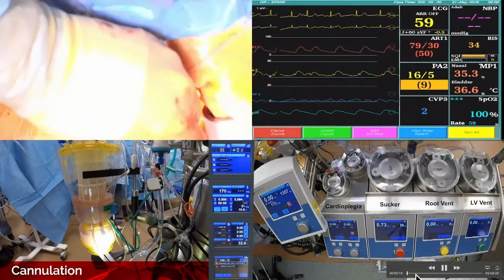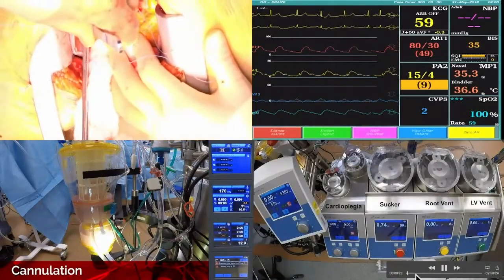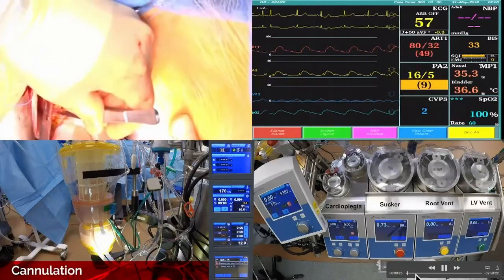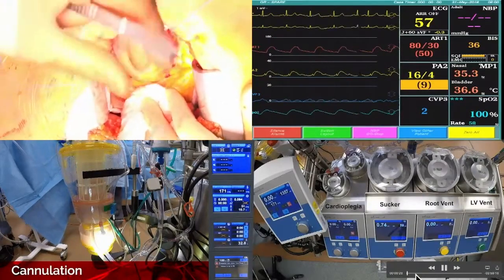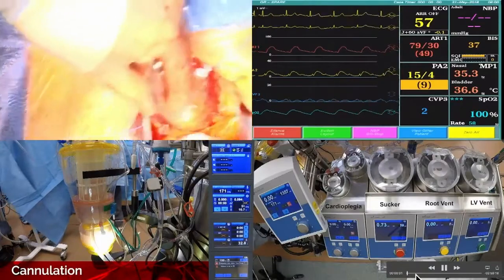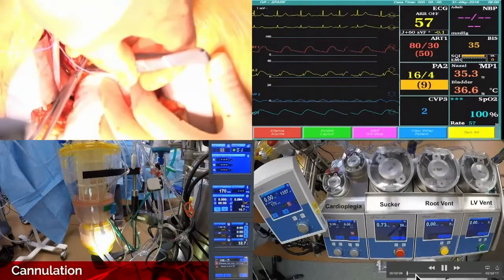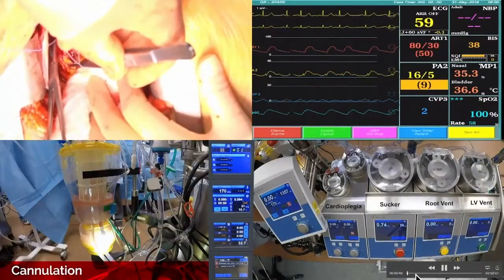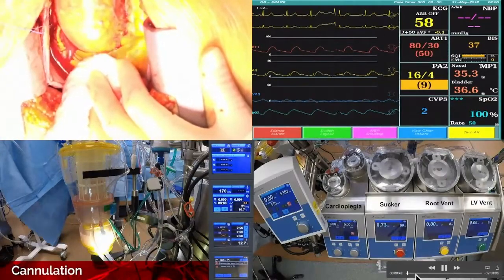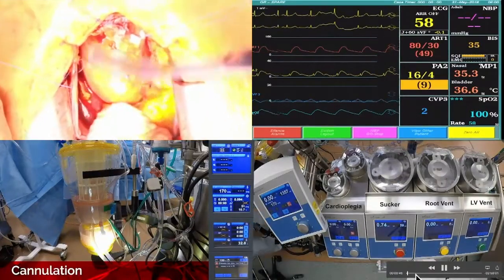So what I was trying to do is preserve the native aortic valve because the leaflets were fairly normal in appearance on the TEE. The plan was to tighten up the sinotubular junction. She's an older lady, so we want to make this really quick. Sometimes simply doing that can allow the leaflets to coapt better. And you'll see that we gave it a shot. It looked pretty competent.